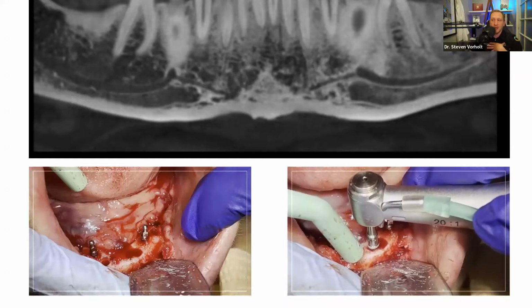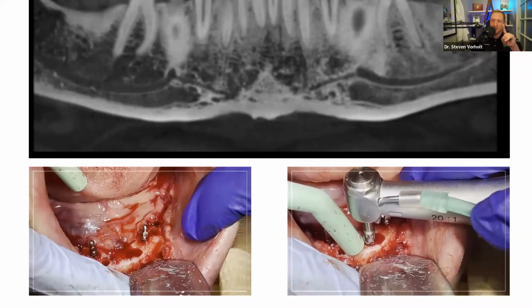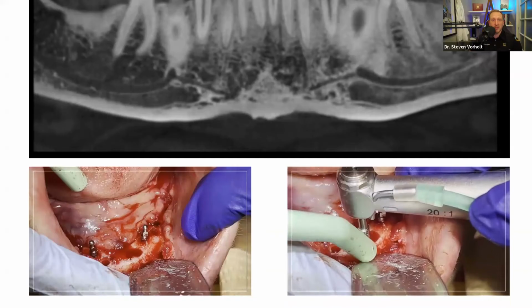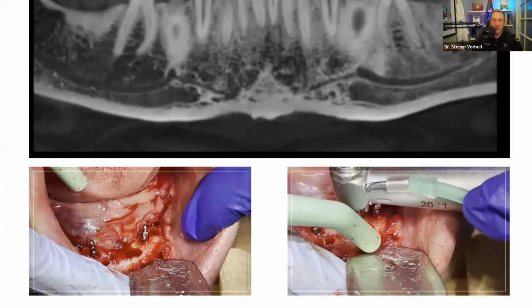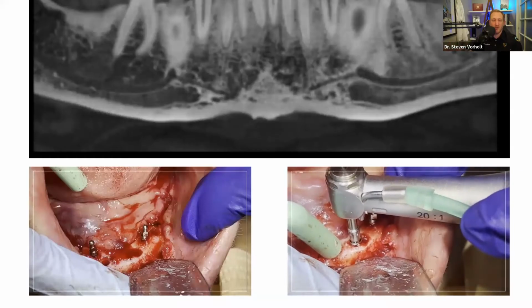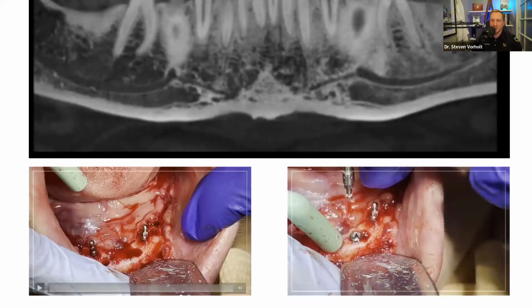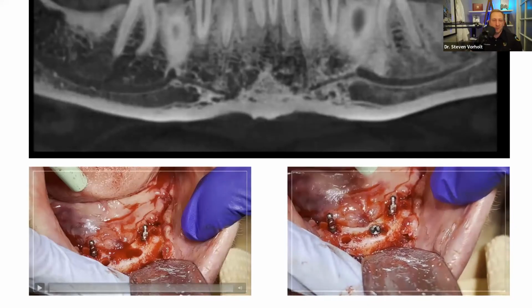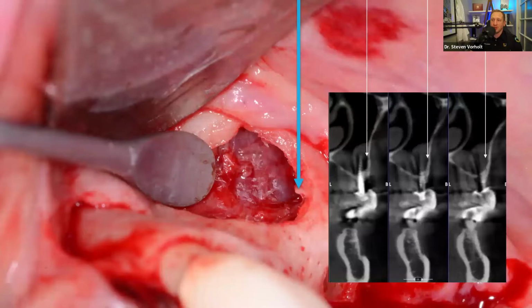And so it's an afterthought, but it's nice to see it on the CT before you get there. So, hey, I might have a bleed here. Maybe that's going to force me to not sequentially drill all 4 of my osteotomies, but go ahead and quickly finish that one so that I can get the bleeding to cease. And as you see there, once the implant's placed, of course, there's no more bleed. So that's the kind of thing we can see at 0.2 without issue.